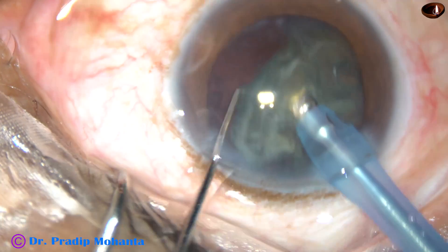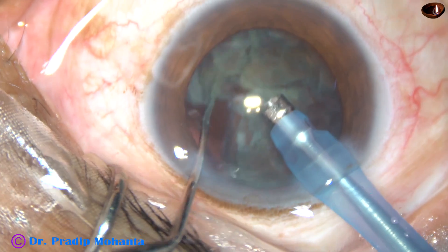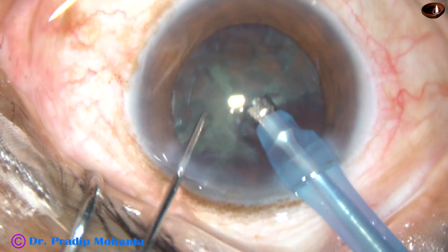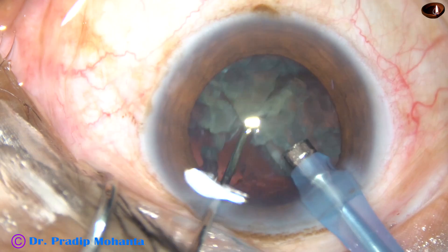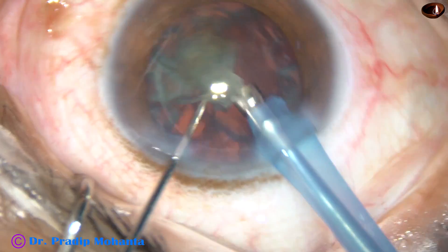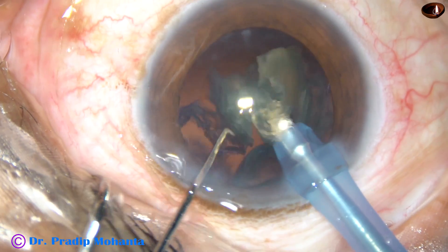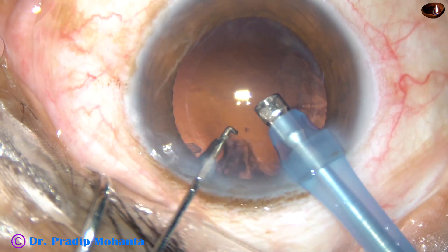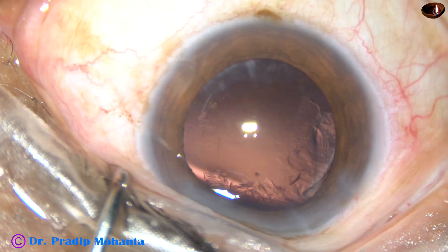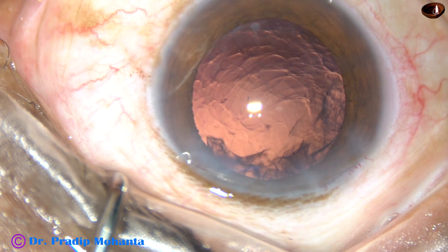This is also a partial crack. What I am doing at this moment — I must not try to catch hold of these pieces with the FACO needle. I will rotate it, lift these fragments a little up, and then use the tip. This is the key message in this video: lift the pieces and then use your FACO needle. Don't go near the posterior capsule and don't try to catch hold of those. If you do that, the risk of posterior capsular rent increases.